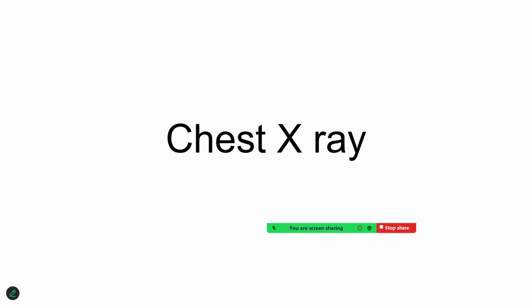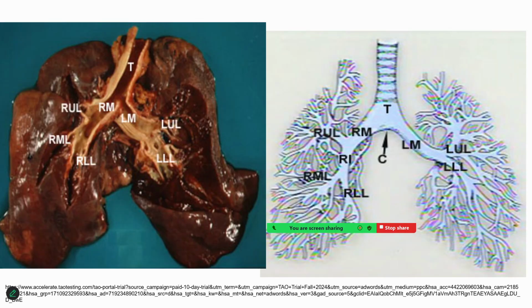Now I am supposed to talk about chest X-ray in relation to the respiratory disorders. X-ray is one of the simplest, or rather, most economical means of investigating diseases related to the respiratory tract, and most commonly used also. The basics of radiology are based upon the structure which you have and its radiation coefficient.